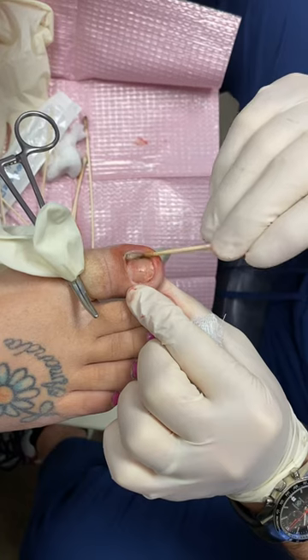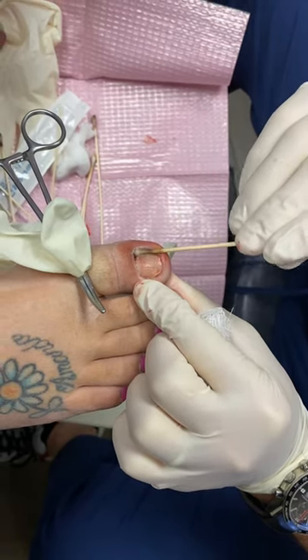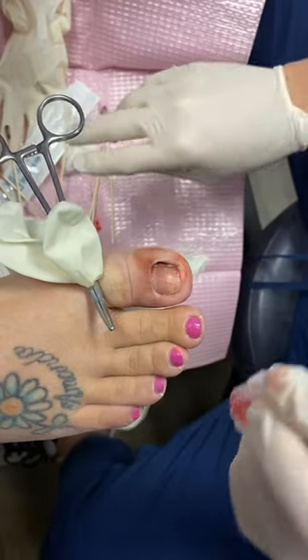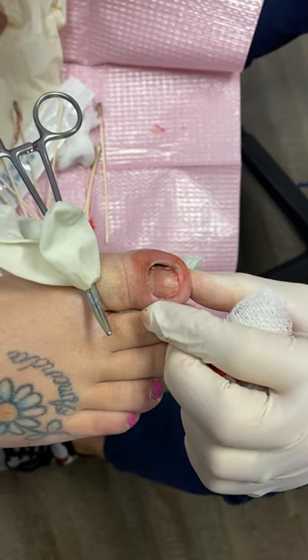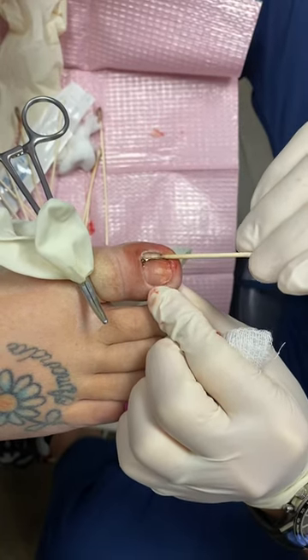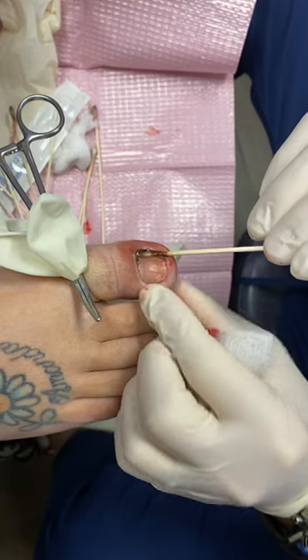Some people get some residual scar tissue that we'll cut out, but generally speaking, this has a very high success rate. This patient is oozing a little bit because she has a history of taking blood thinners. Sometimes patients on blood thinners will still ooze a little. The advantage of using the acid is it will also cauterize — you're seeing that turning black because once the acid hits the blood, it's cauterizing, meaning stopping the bleeding.